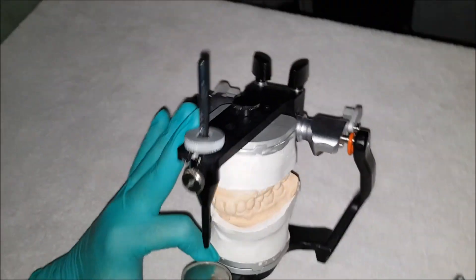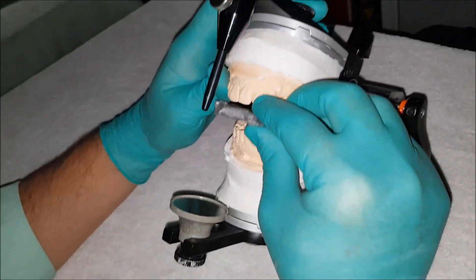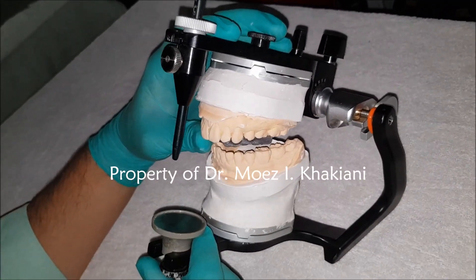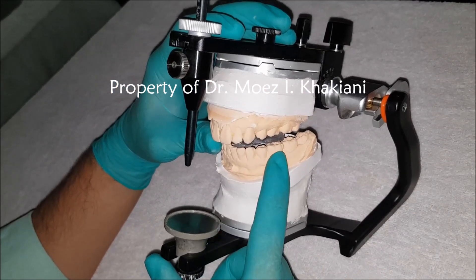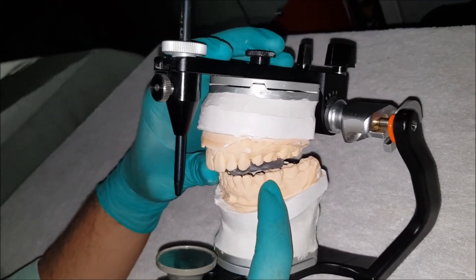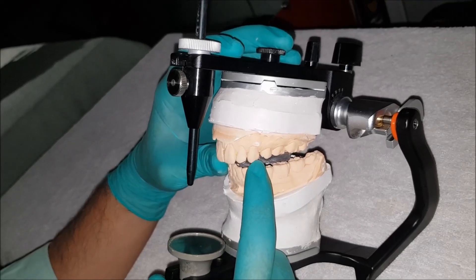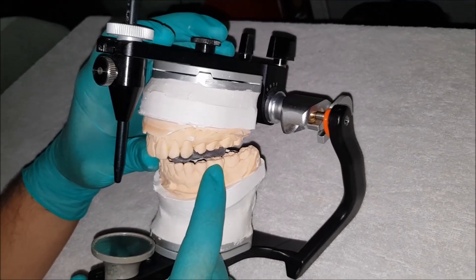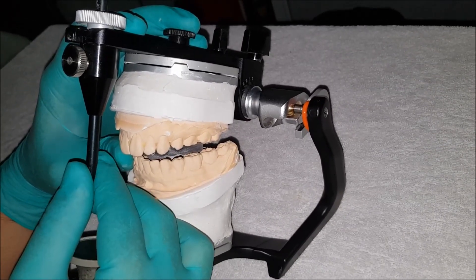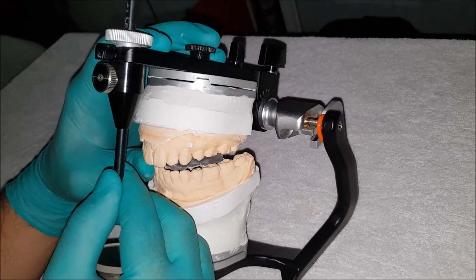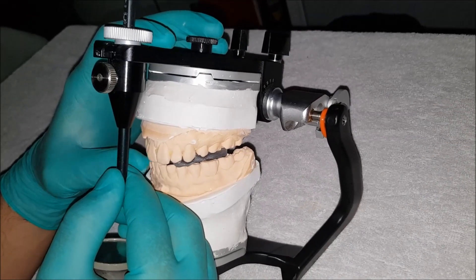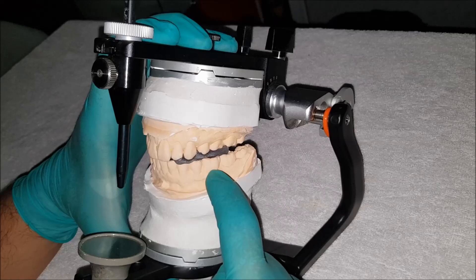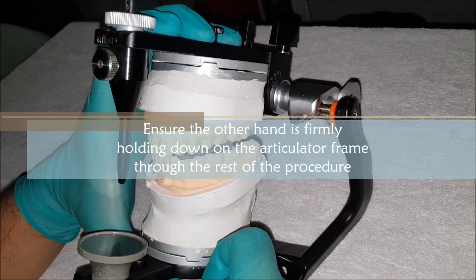We now take the protrusive record and we seat it on the maxillary cast. As I close down, you can appreciate that the teeth do not intercuspate into the wax wafer. This is because the casts are mounted in CR, but the record is protrusive. So to take the mandibular cast into the record, what I have to do is gently push the maxillary frame behind. And as I push that, you can now appreciate that the mandibular teeth go and fit into the indents perfectly.